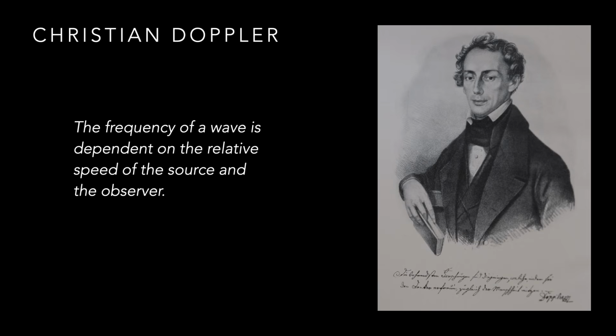Applying this to us, the ultrasound probe is going to send out a sound wave at a certain frequency, and we receive it back at a measured frequency. If the thing it's interacting with in the process of transiting through the body is moving, that movement may also have an effect on the frequency of the wave that's coming back on the ultrasound.